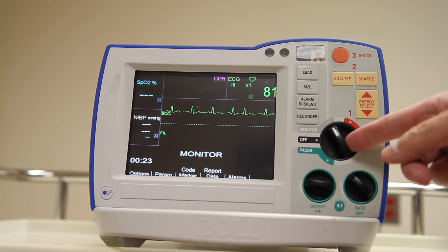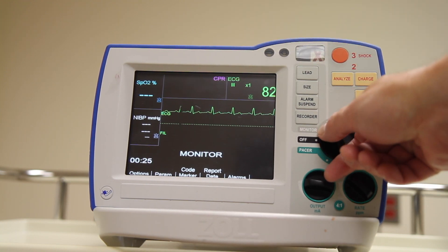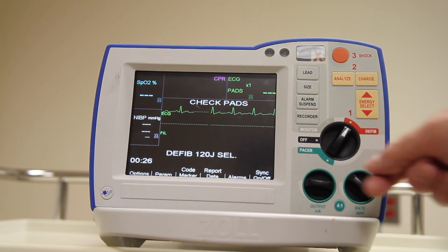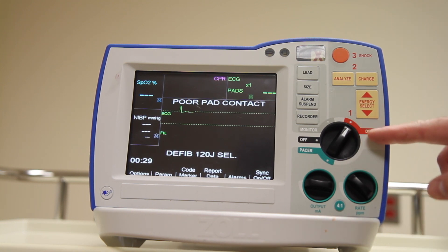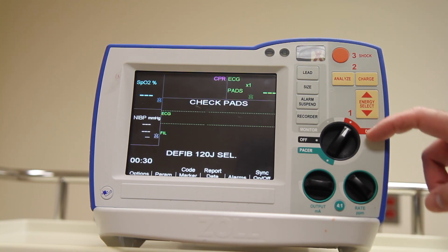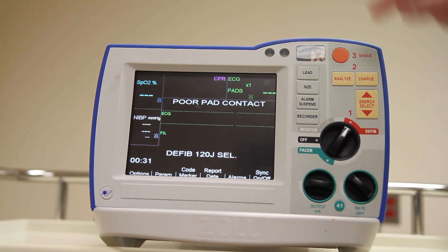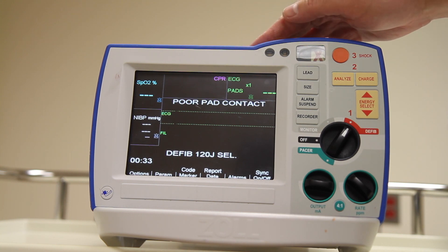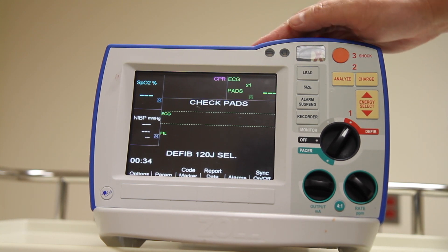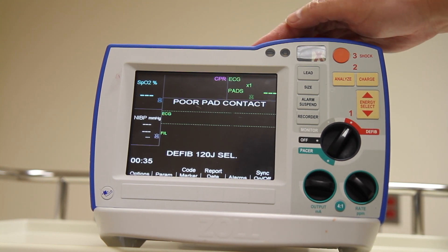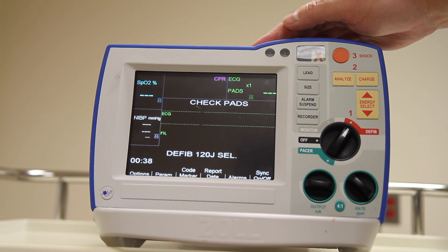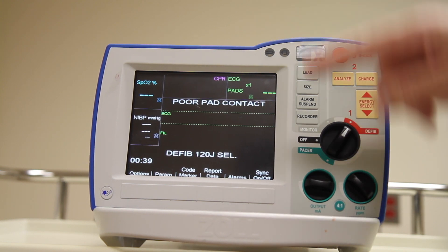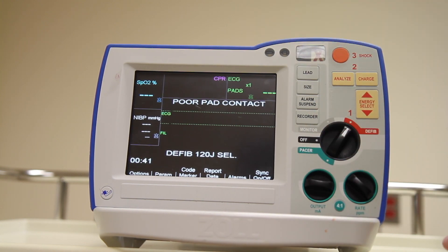Turning the dial to the position labeled defibrillator will again default to the hands-free pad mode, since that's what we're going to use to perform the electrical intervention. The same applies if we switch it into pacer mode.